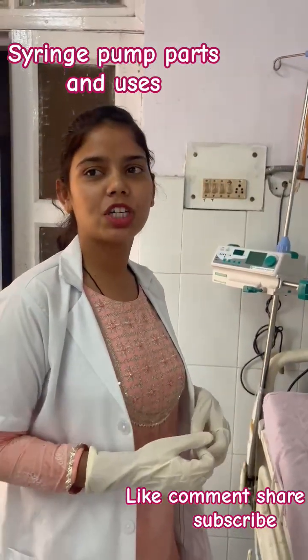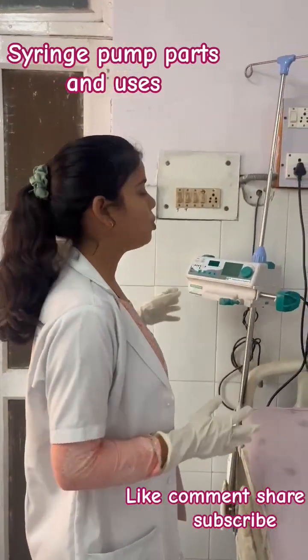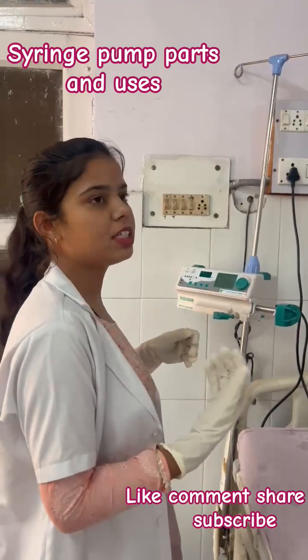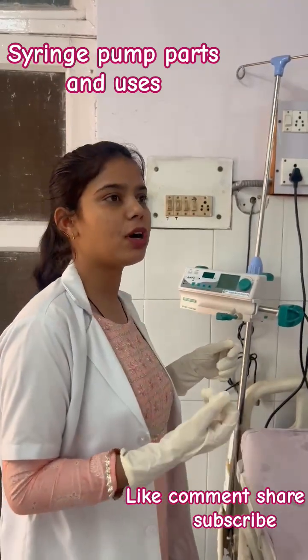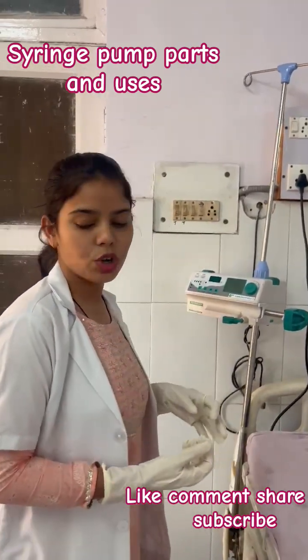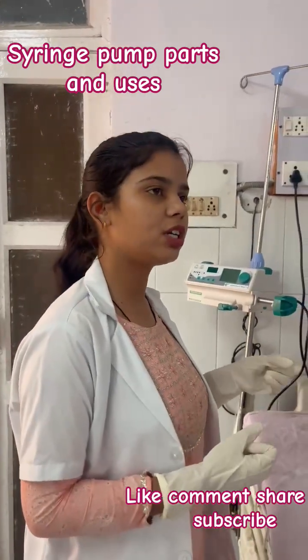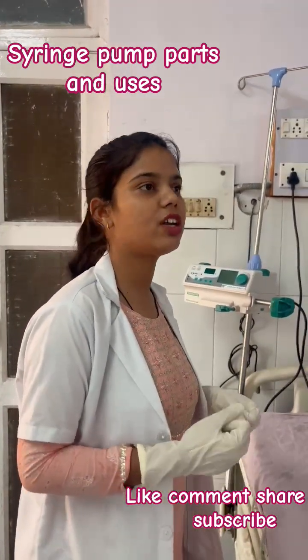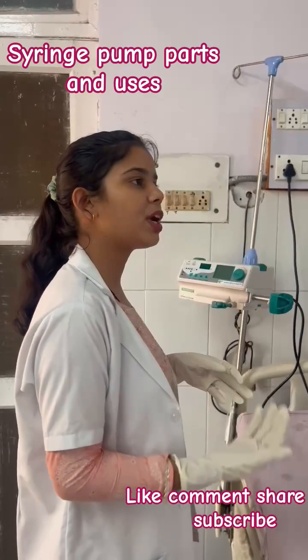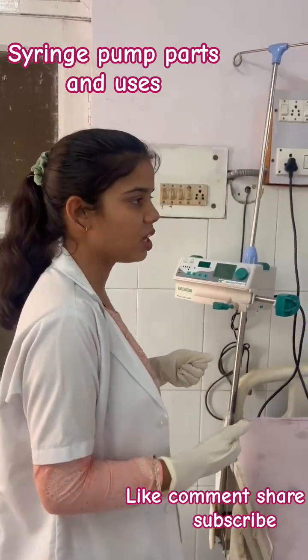Today I am going to demonstrate the procedure of how to use an infusion pump or syringe pump to administer a prescribed amount of fluid to the patient. Before starting the procedure, you have to explain the procedure to the patient and obtain verbal consent. After that, prepare the environment and prepare the patient.